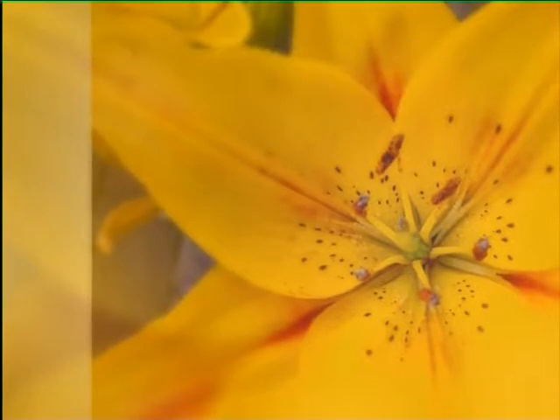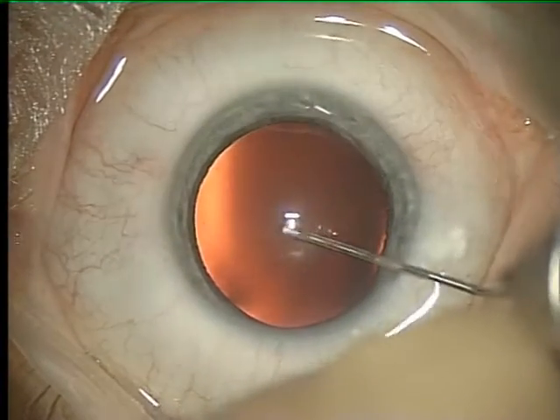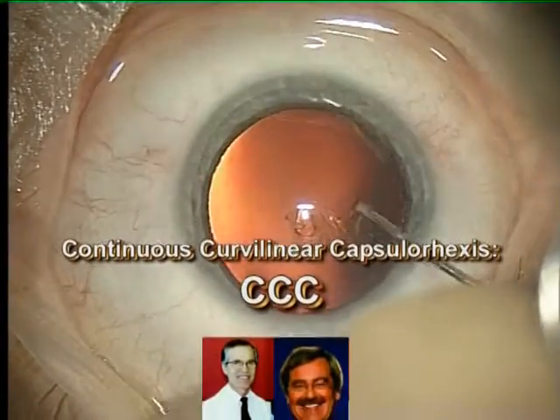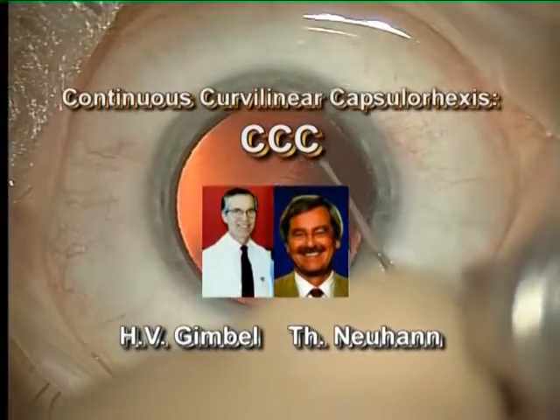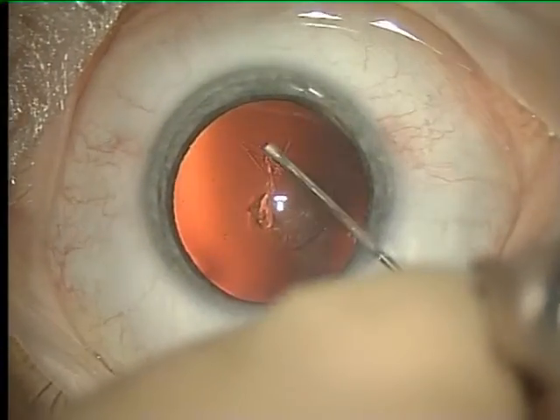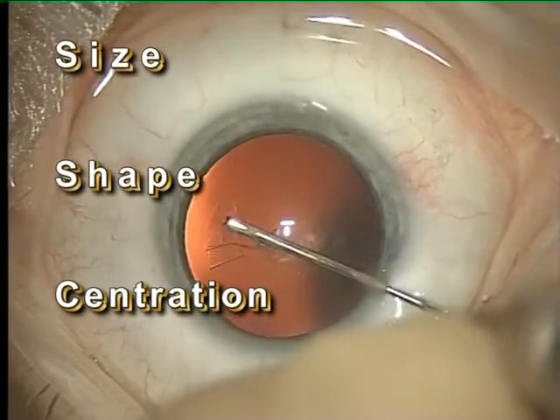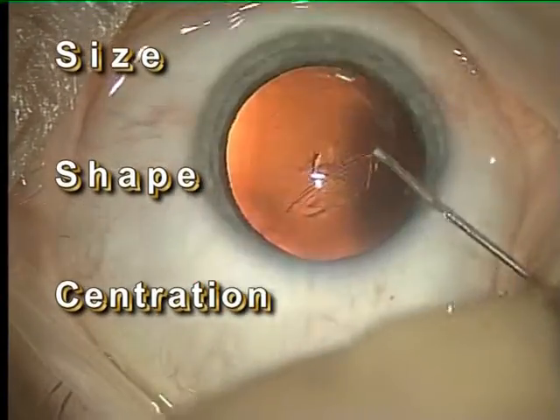The continuous curvilinear capsulorrhexis was developed equally and independently by Gimbel and Neuhan in 1985. Since then, it has become an indispensable part of modern cataract surgery. The exact size, shape, and centration of the CCC are of growing importance.